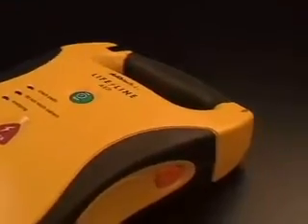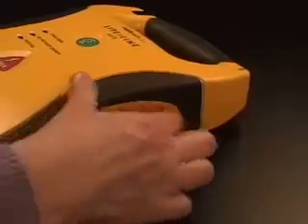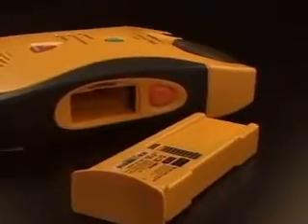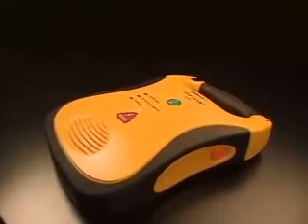Remove the battery pack by pressing the battery eject button until the battery pack is partially ejected. The battery pack may then be completely removed by pulling it out. Always store the AED with the battery pack installed.